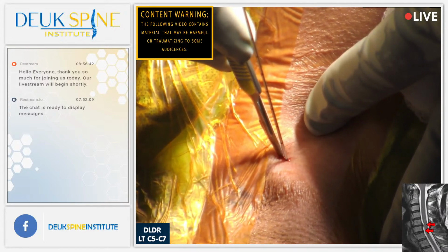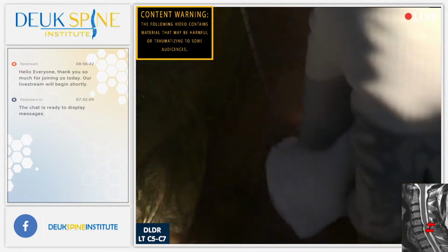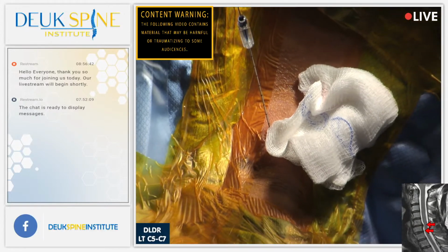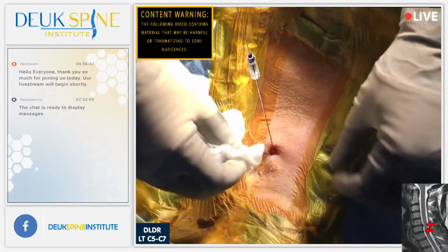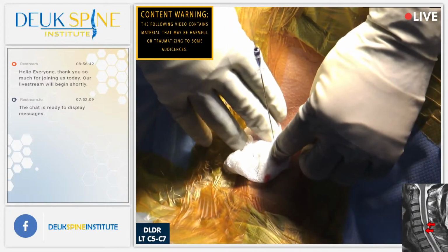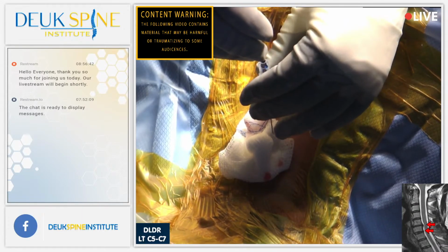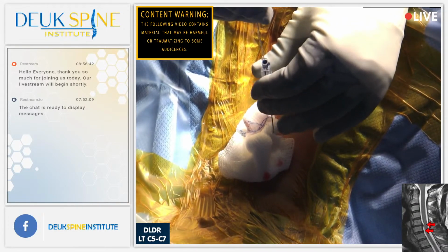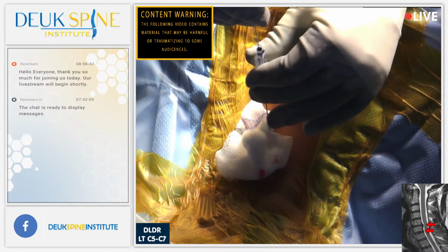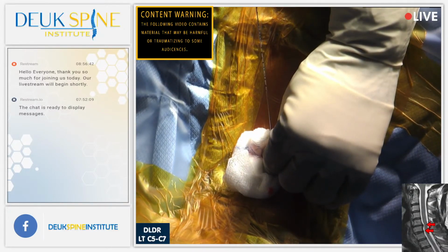All right, so we're going to make a 4mm incision. This entire surgery, folks, is going to be essentially a bloodless surgery done with a 4mm incision. Okay, we're going to have maybe 1 or 2 drops of blood, that's it. Our patient travels to Florida from Canada for our lovely weather and for our services. At this point, I've made the incision. It's 4mm. It's a Band-Aid incision. Let me see. We're taking the spinal needle out, and I'm going to leave the guide wire.